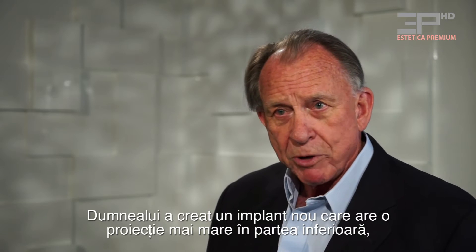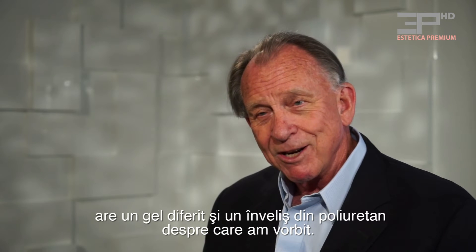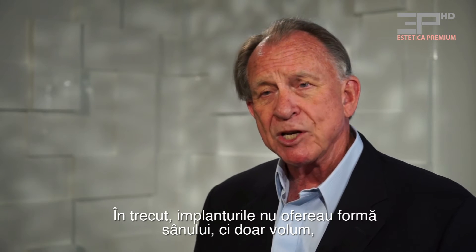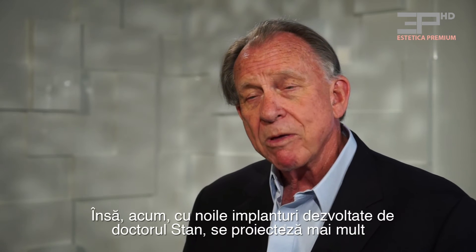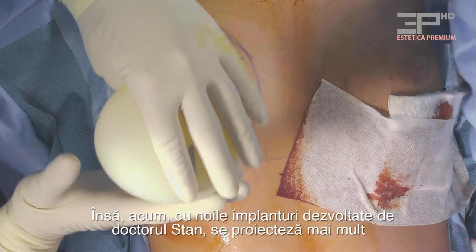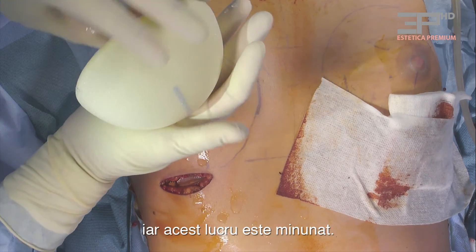He's designed a new implant that has more projection in the lower pole, a different gel, and a polyurethane cover. It's a very exciting new implant because it actually gives a better shape to the breast. In the past, the implant didn't really give shape — it just gave mass. But now with Dr. Stan's new implant, it projects more of the lower pole, pushing things up from the bottom.